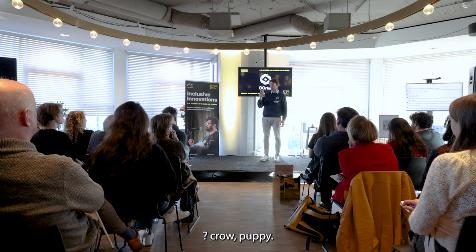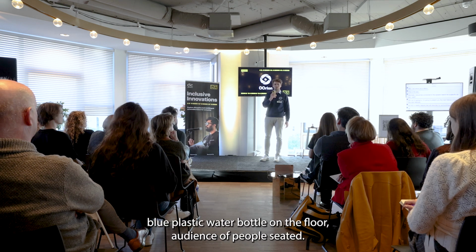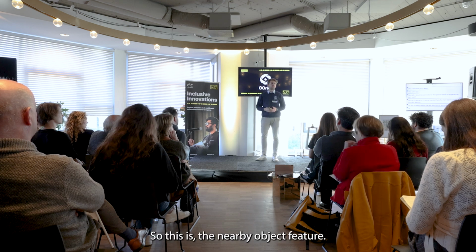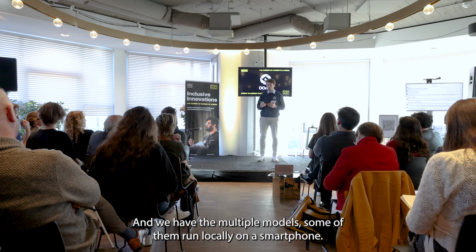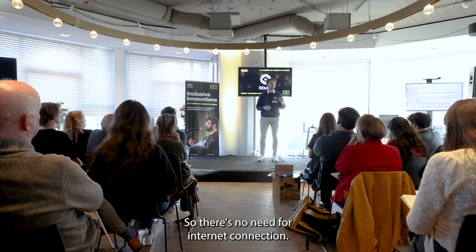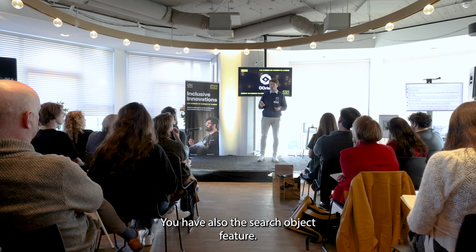Black chairs arranged in rows, blue plastic water bottle on the floor, audience of people seated. So this is the nearby object feature. We have multiple models. Some of them run locally on the smartphone, so there is no need for an internet connection. You have also the search object feature.